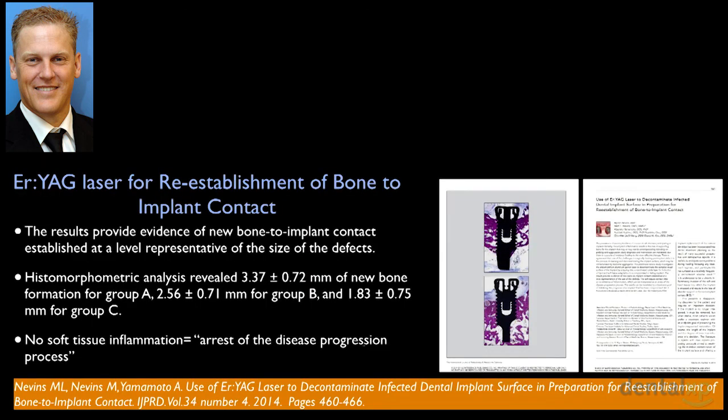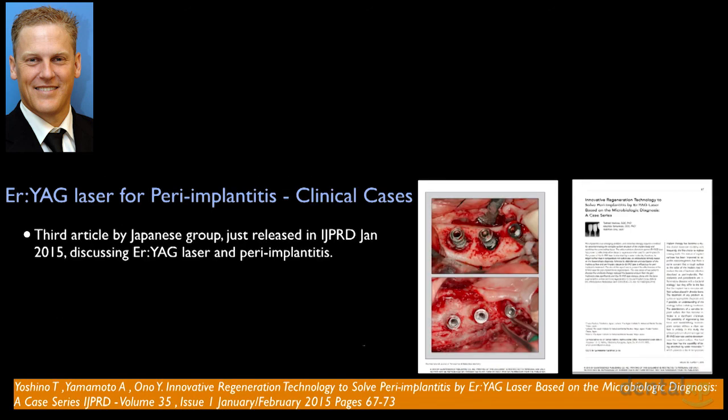So they concluded that, indeed, the implant that you had could have vertical regeneration. And what they found in the conclusion was there was no soft tissue inflammation at all, and they termed the conclusion that there was an arrest of the disease progression process. So now it was time to turn these studies to humans.